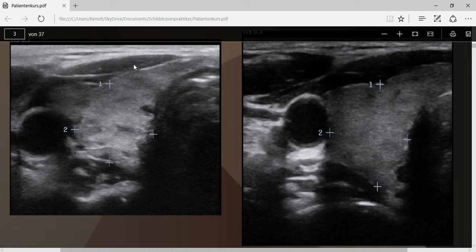It's kind of whitish, it's more light, which is a typical change that you see when you have an inflammation of the thyroid, which moves across the borders of the organ and affects the surrounding tissues, and that is kind of an inflammation of the muscles and an inflammation of connective tissue. When you look at the muscles here, they have regained a normal structure also. They are much darker, as muscles should be.